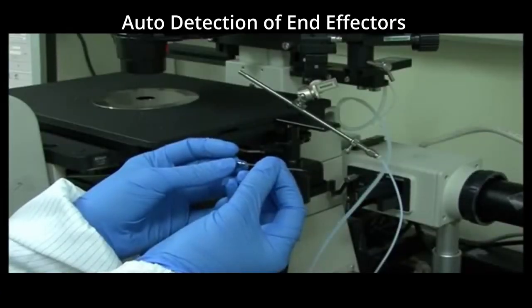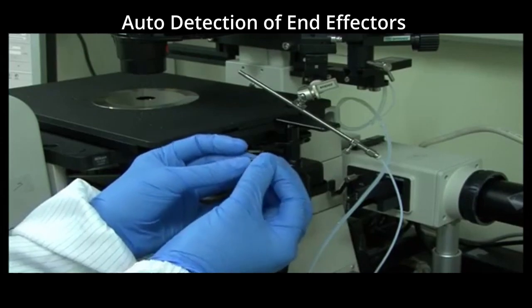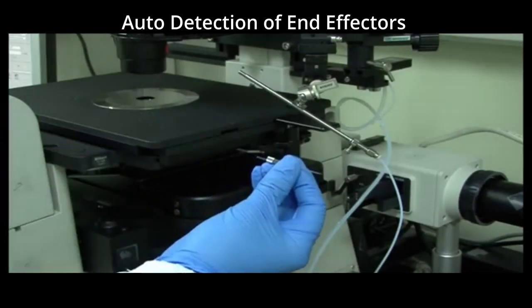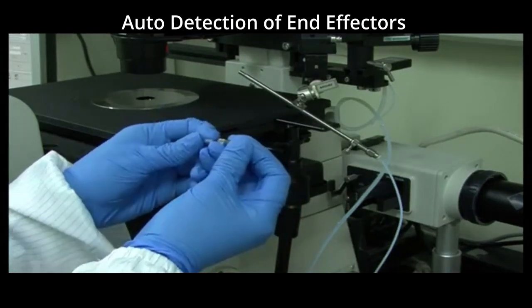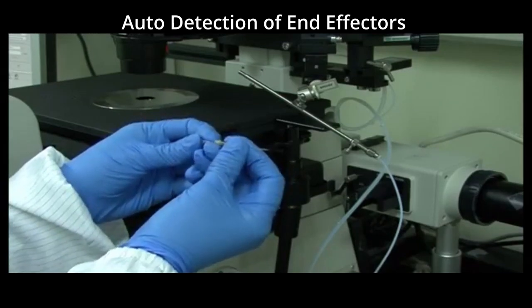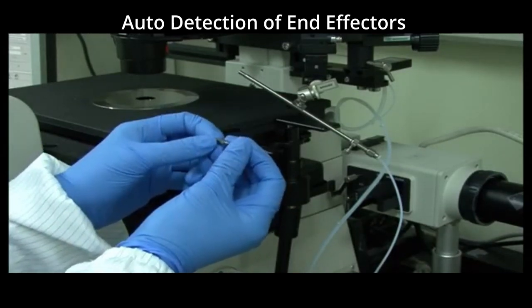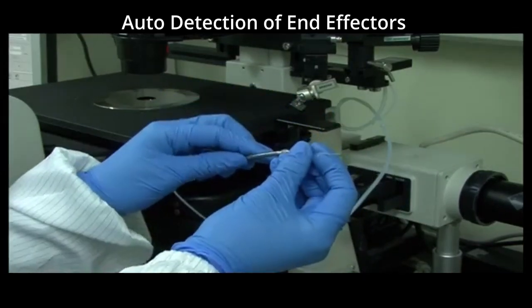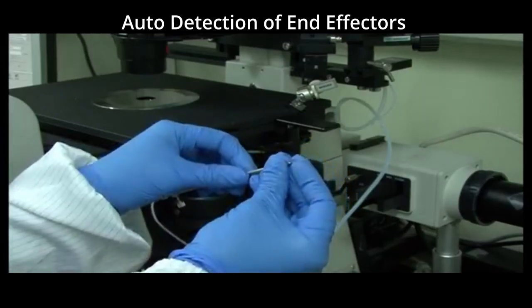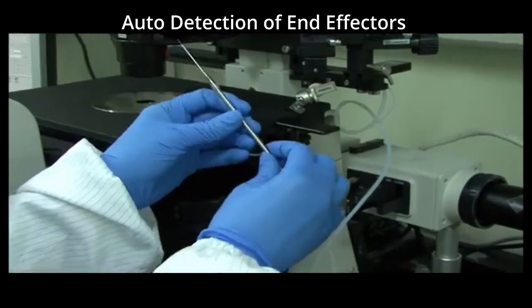With how great micromanipulators are, there are still some issues that need improving. A big improvement to be made in micromanipulators is the auto detection of end effectors. During sperm injection, the tips of the micromanipulator must be manually aligned before fertilizing the eggs. If this process becomes automated, it can save embryologists time. A solution for this is automatically locating the end effectors to align them accordingly. The big challenge is that the tips of a micromanipulator are micrometers in size and can be easily damaged if they are collided into.